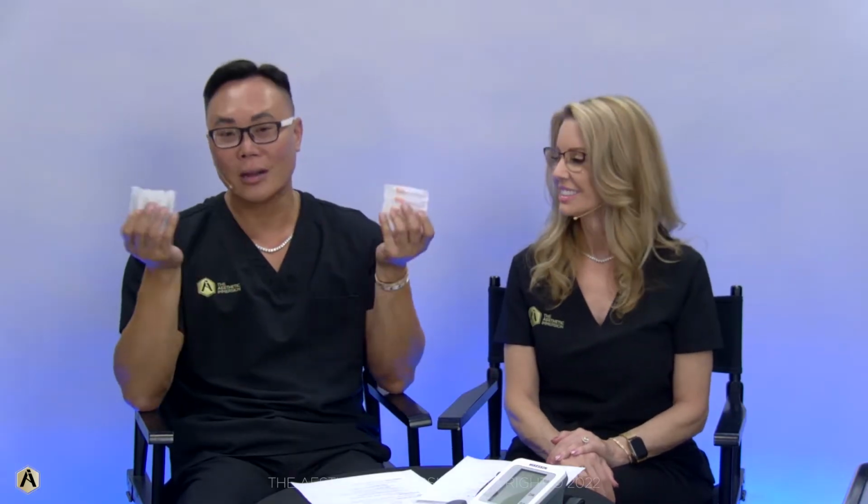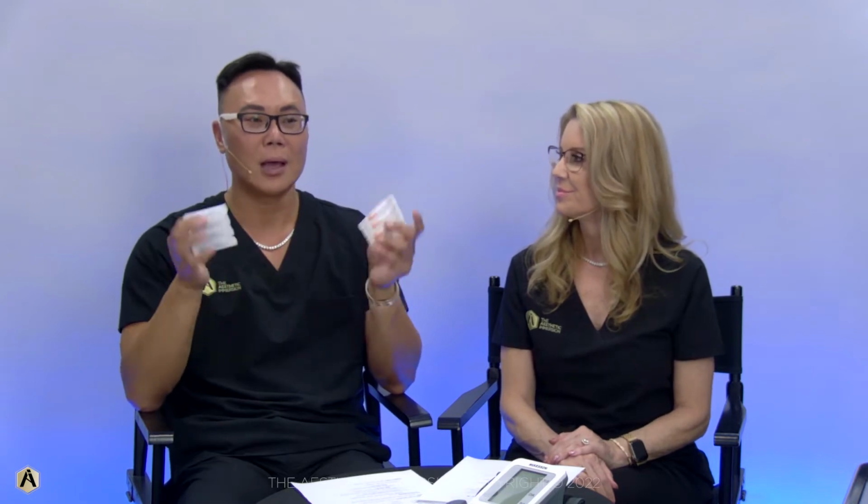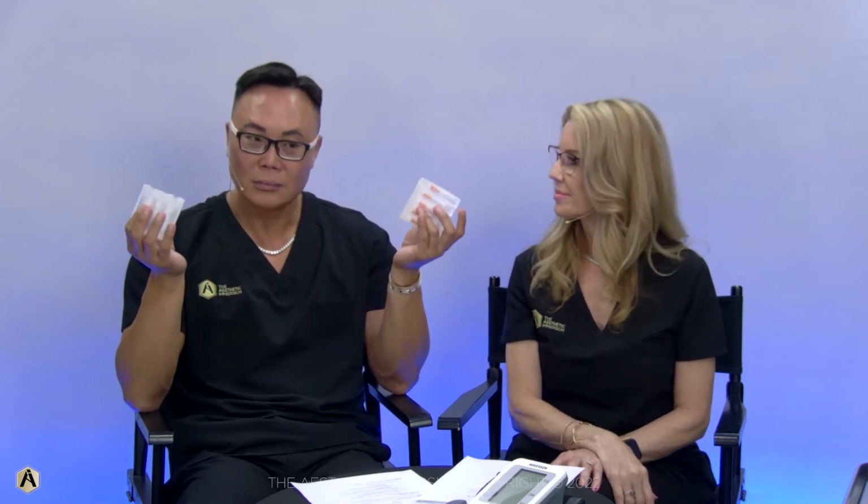Like when I teach and I have to inject on stage, it pains me because when you're teaching or injecting for some of these companies, you have to follow FDA guidelines, and I don't know why they think having a different needle on the syringe is off-label. That's the reason why you see all of us inject with the little half inches when we have to do videos or webinars or live in-person demonstrations on stage for you guys. It's not my way of doing things.